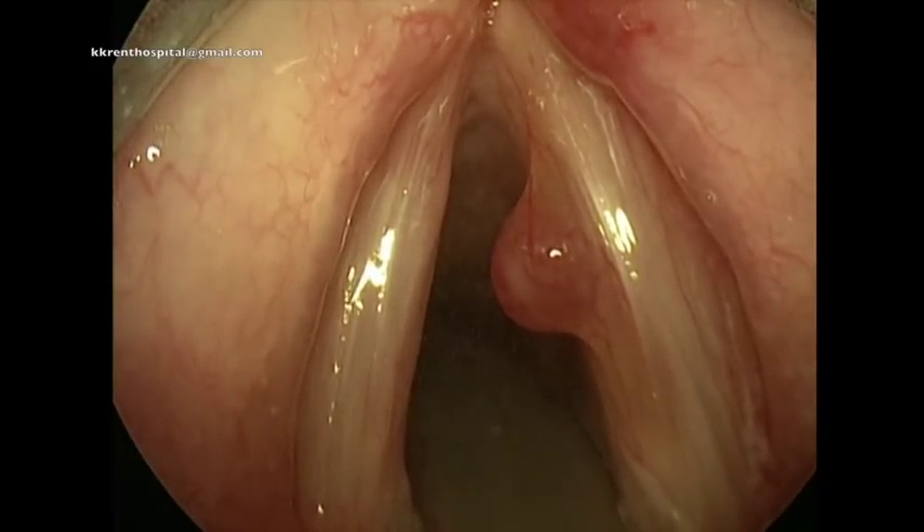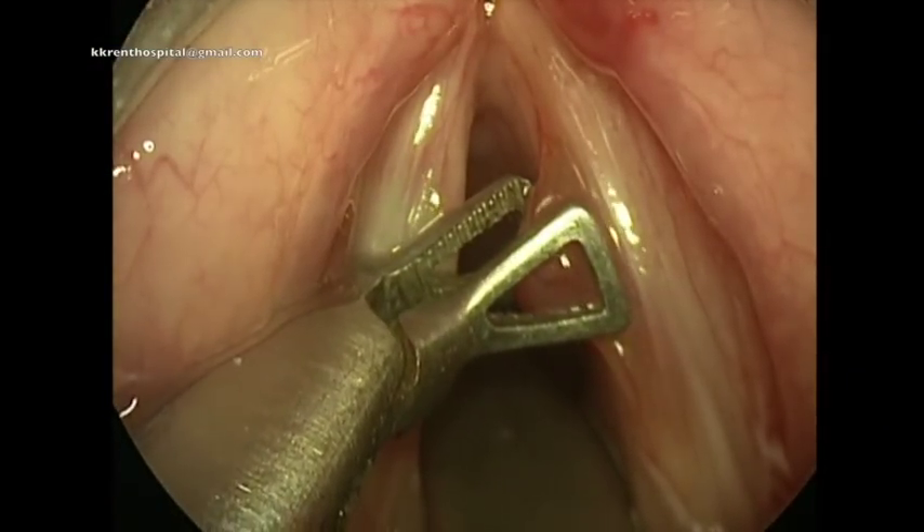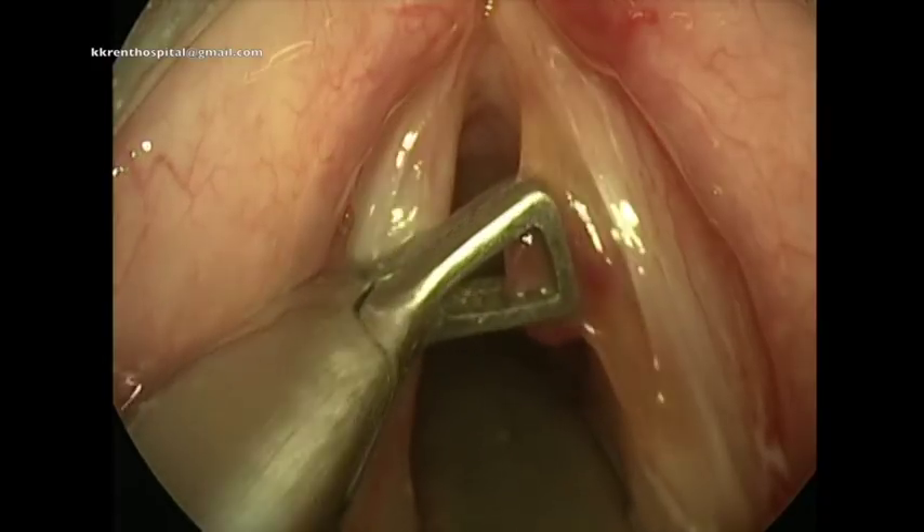The micro laryngeal scope is placed with the scope holder, and with the endoscopic view, the procedure is being done.